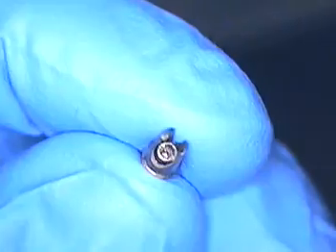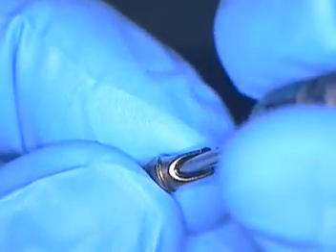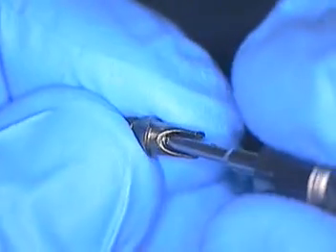Anything rolling around in there? Did you taste something? Did you feel anything? Thank you. Yeah, it was one of them — that's all right, we've got yours still. We'll use it. I'll order another one.